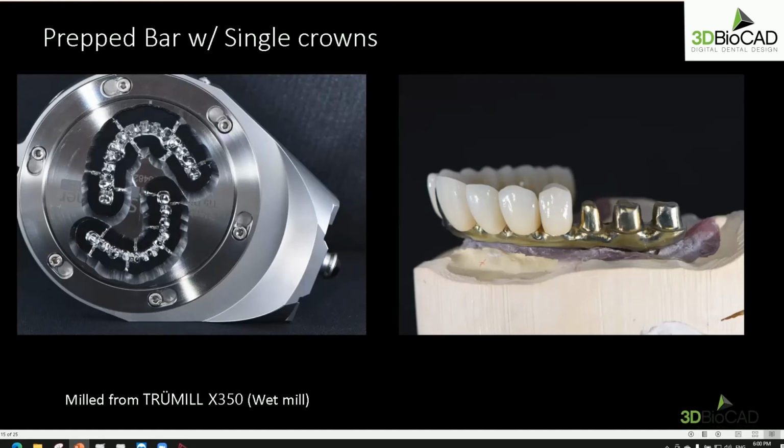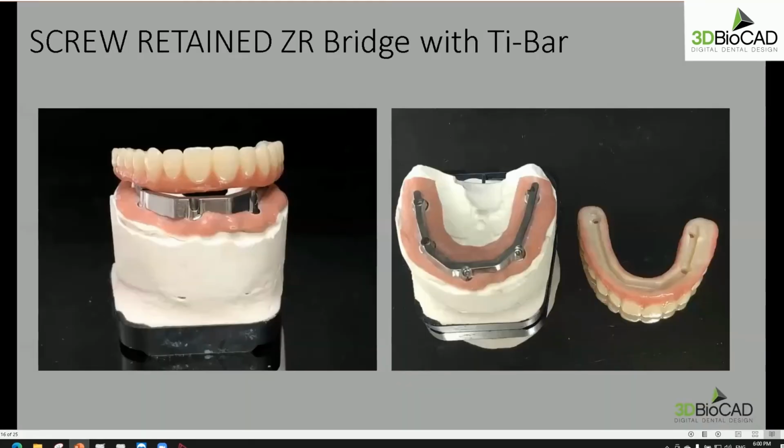And very recently, I think from last year, some cases go this way, which is a titanium bar with about a 2 to 4 degree primary angle and a zirconia whole bridge on top of it, bonded to each other. All the designs which I show you today are all designed by 3Shape. That's what I want to tell you first.